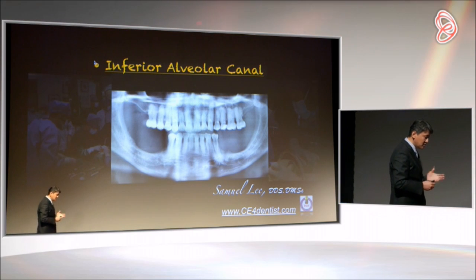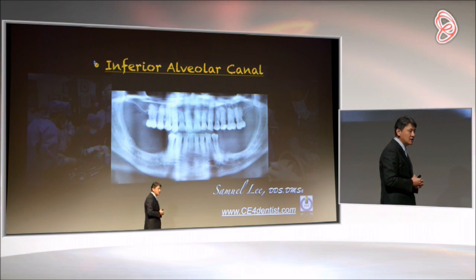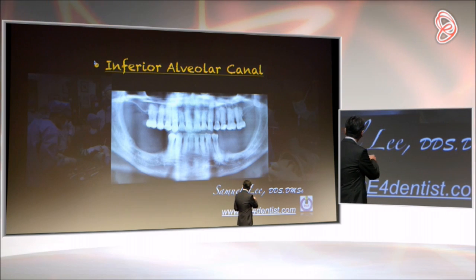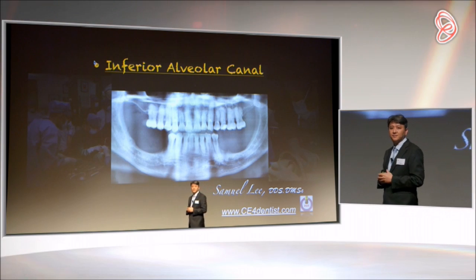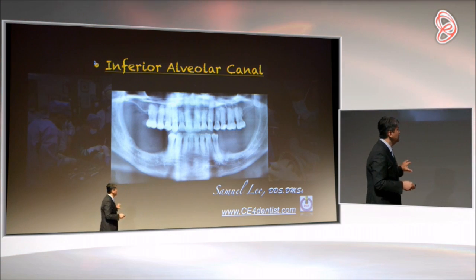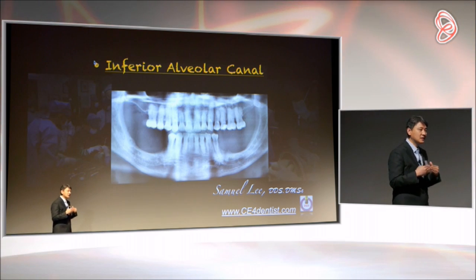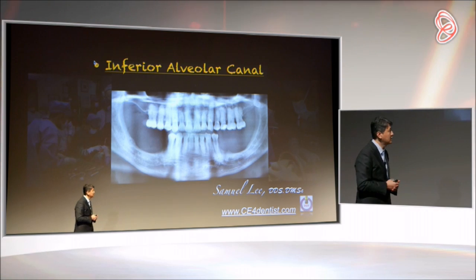Lastly, this patient flew all the way from Africa to get treated in San Diego because nobody dared to touch this patient. As you can see, the mandibular nerve is so low that putting an implant is too risky. And nobody wanted to touch this patient. When he came to my practice, he told me he's a very busy person. He cannot afford to come back to San Diego, and he was seeking a very predictable technique where he doesn't need to come back all the way from Africa.